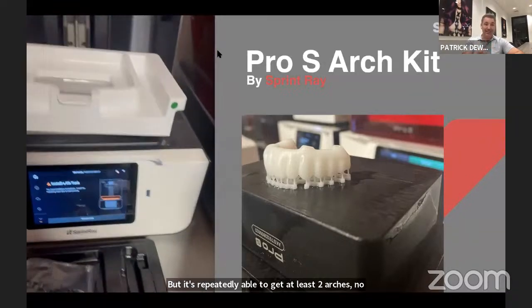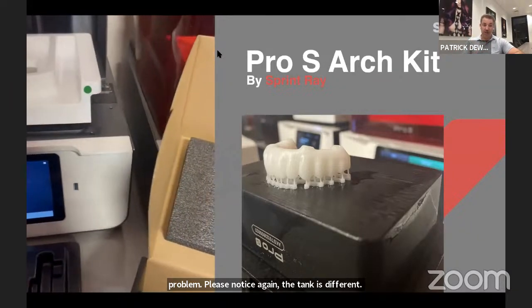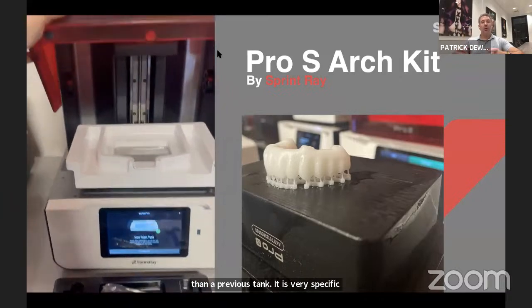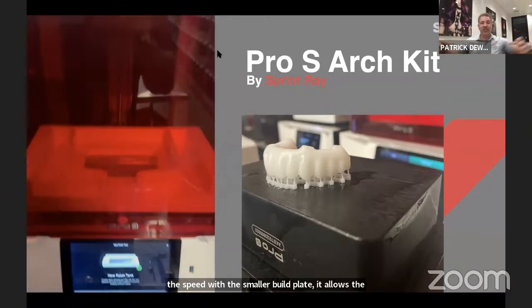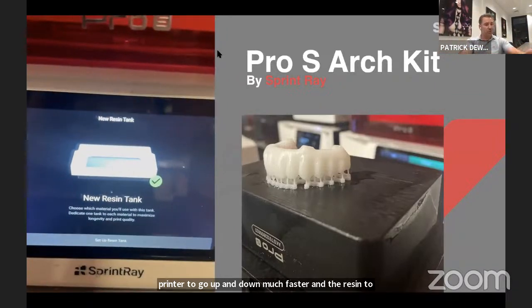Please notice again, the tank is different. So if you do have a Sprint Ray, the tank is much smaller than the previous tank. It is very specific to increase the speed. With the smaller build plate, it allows the printer to go up and down much faster and the resin to get underneath so you can print effectively. What's cool also about Sprint Ray is they notify you which tank and which resin is in the tank. It's a very smart system, so very easy to use.